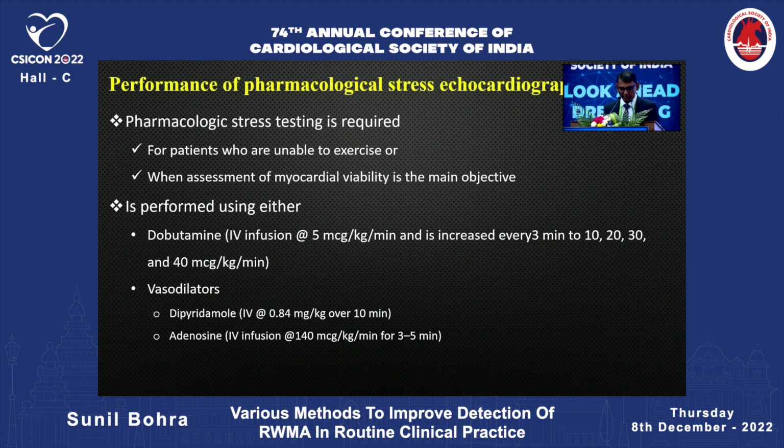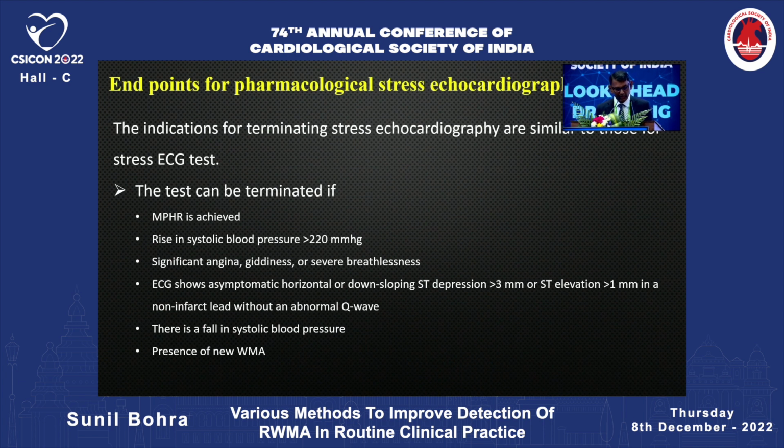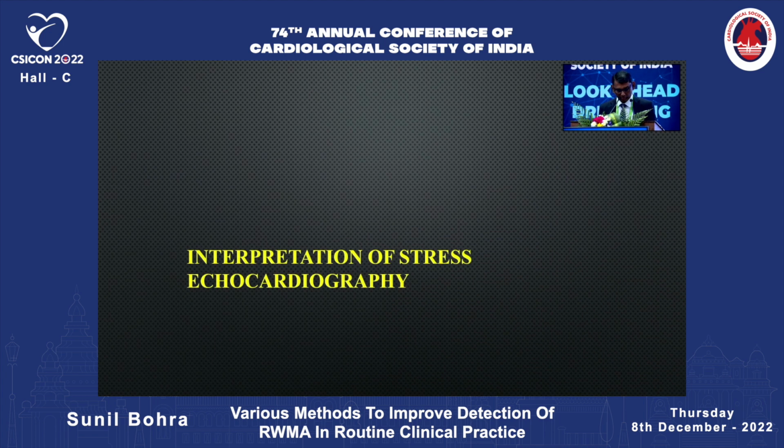Here, most commonly we use dobutamine. With contrast, without contrast, there are some guidelines on protocols to follow. We can always go through this in the document. Indications to stop, again, we look at all these parameters, ECG changes and the blood pressure, and then obviously we need to look at the presence of new wall motion abnormality.